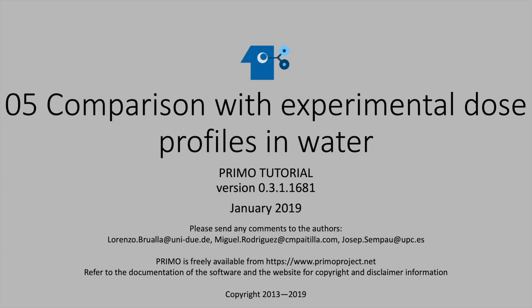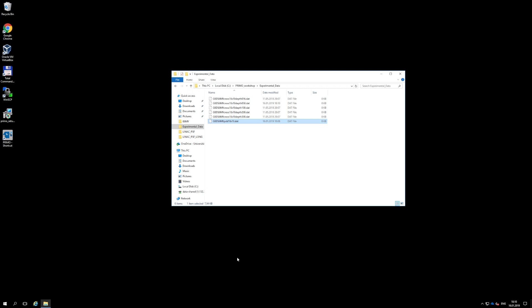To compare simulated absorbed dose distributions in water with experimental dose profiles, it is first necessary to write the latter in a format suitable for Primo.